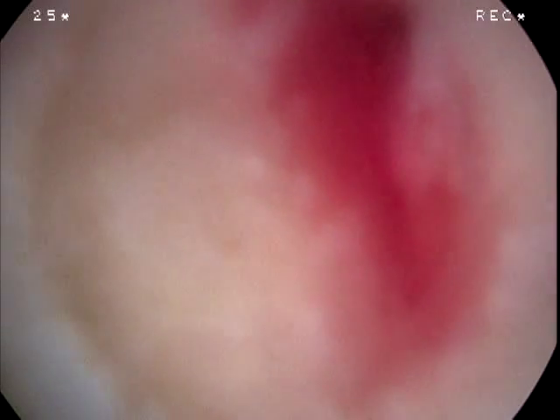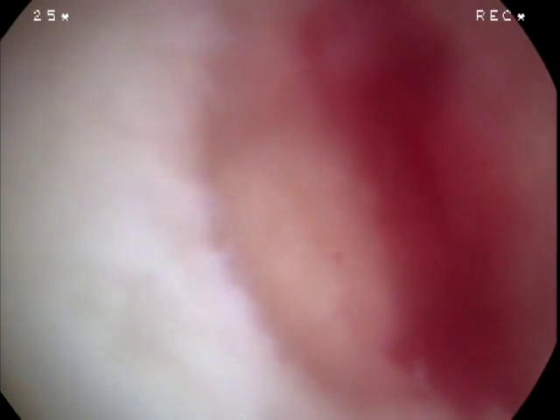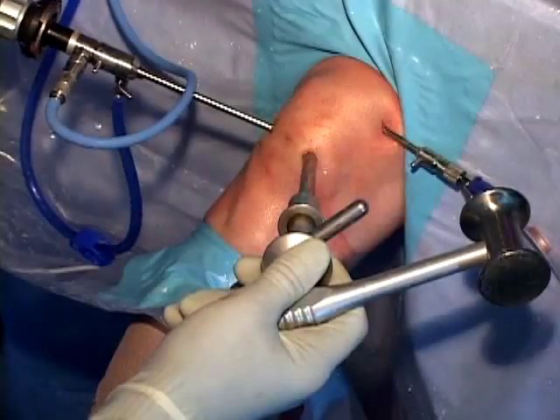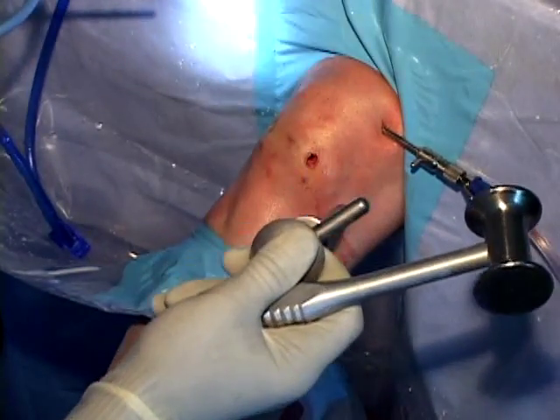At the end of the procedure the water pump can be let down and bleeding confirmed from the prepared lesion. It is the bleeding and blood clot that subsequently forms that keeps the graft in place. A mixture of hyaline cartilage repair tissue and fibrocartilage usually characterizes the repaired lesions in isolated chondral defects as well as arthritic knees. This repair tissue has been successful at providing pain relief for more than 15 years in our athletic patient population.